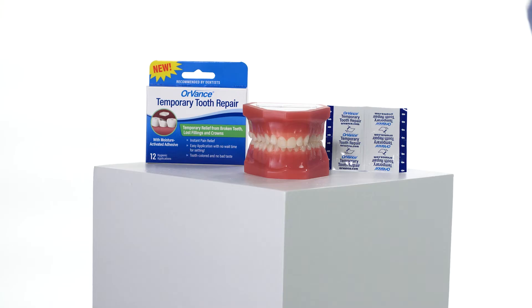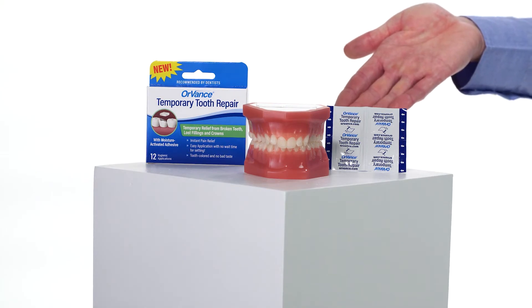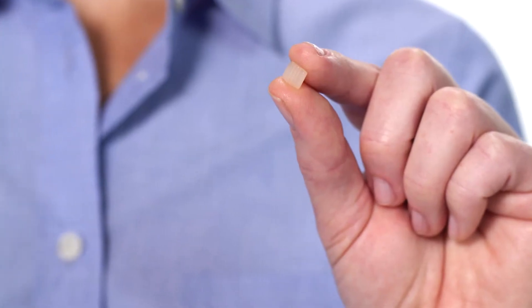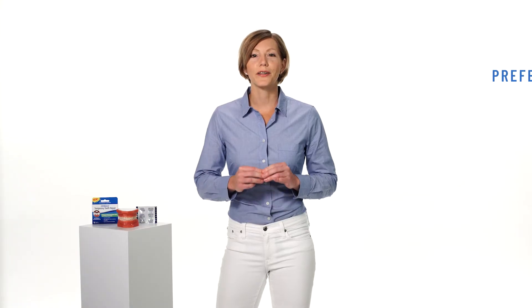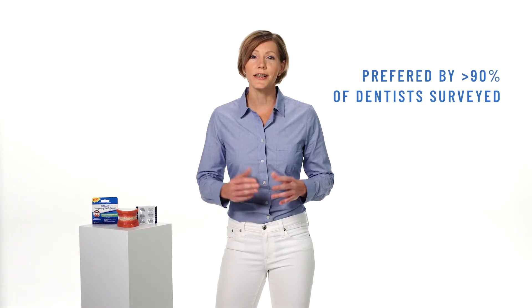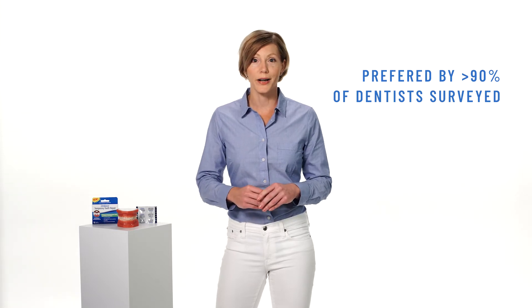If you're looking for temporary relief from a broken tooth, lost filling or crown, you've come to the right place. Introducing Orvance Temporary Tooth Repair, a pliable tooth-colored material that sticks to these problem areas and is preferred by over 90% of dentists surveyed versus the leading at-home dental cement brands.